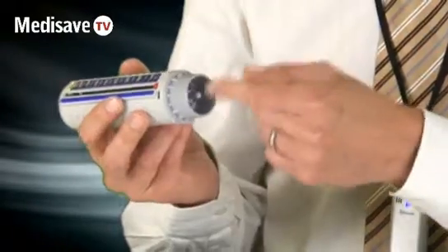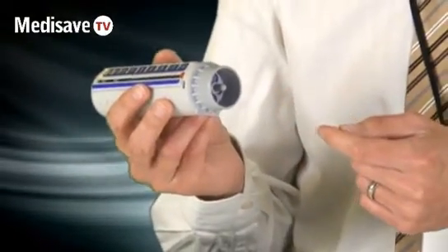It also has an internal one-way valve, so there's no risk of cross-infection between patients if it's used for multiple patients. It's very simple to use.